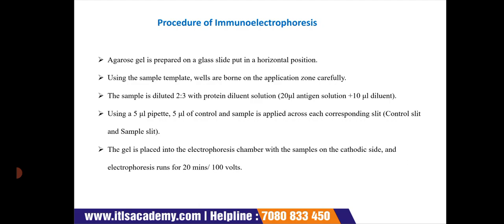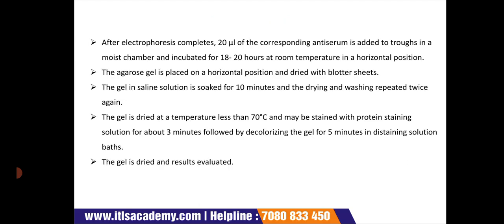Then the gel is placed into the electrophoresis chamber, as we discussed in the previous lecture, with the sample on the cathodic side, meaning the negative side, and the electrophoresis runs for 20 minutes at 100 volts.